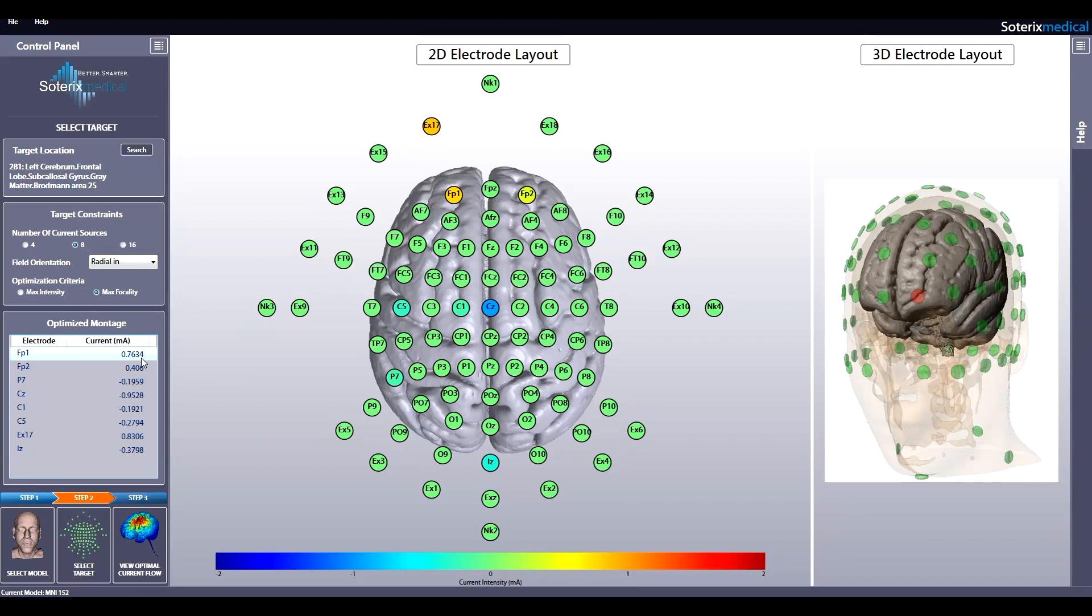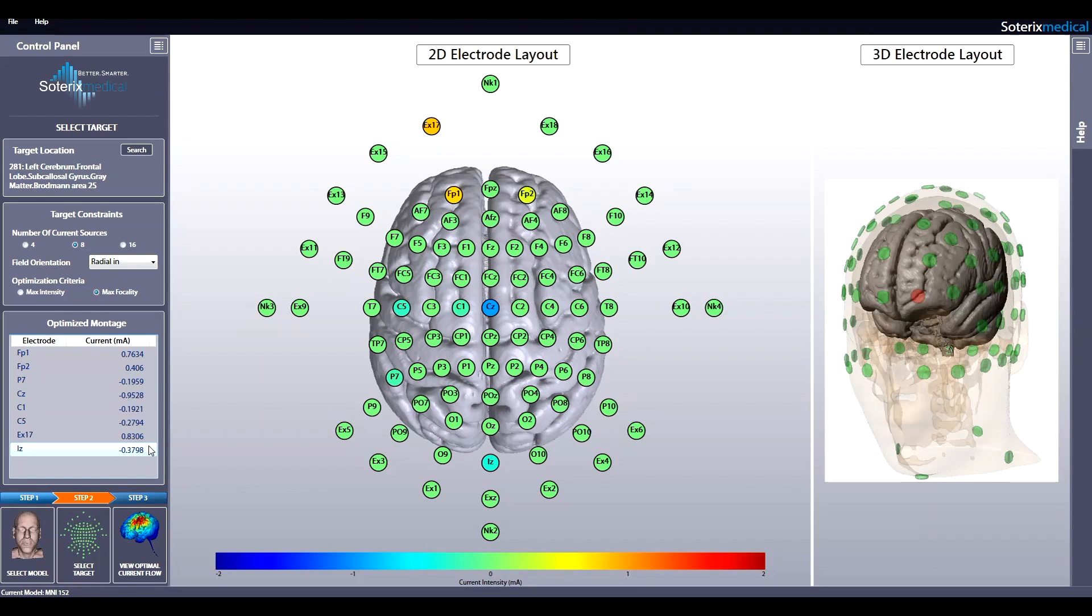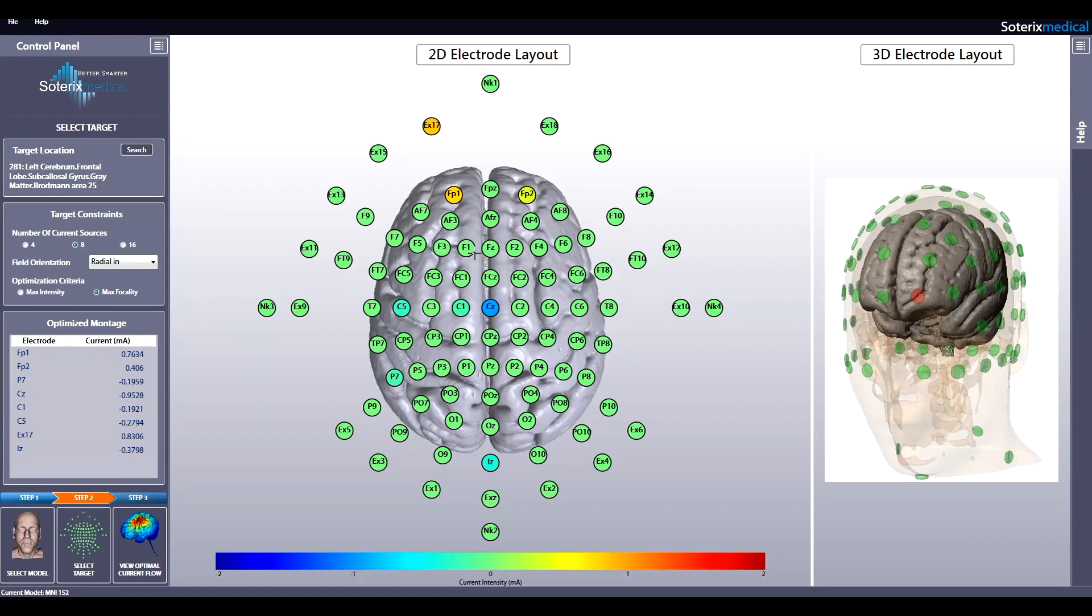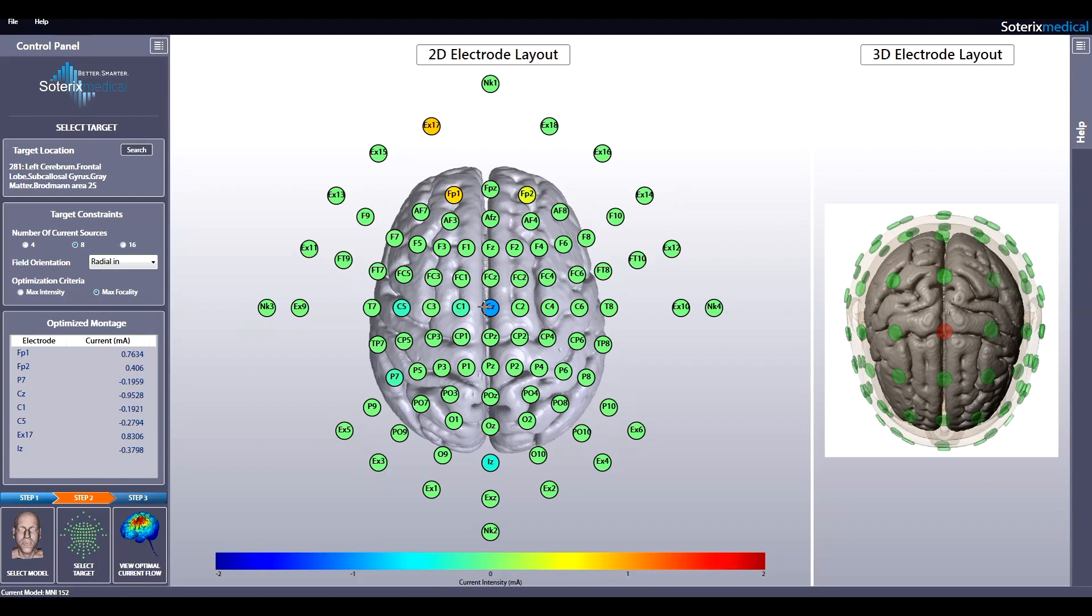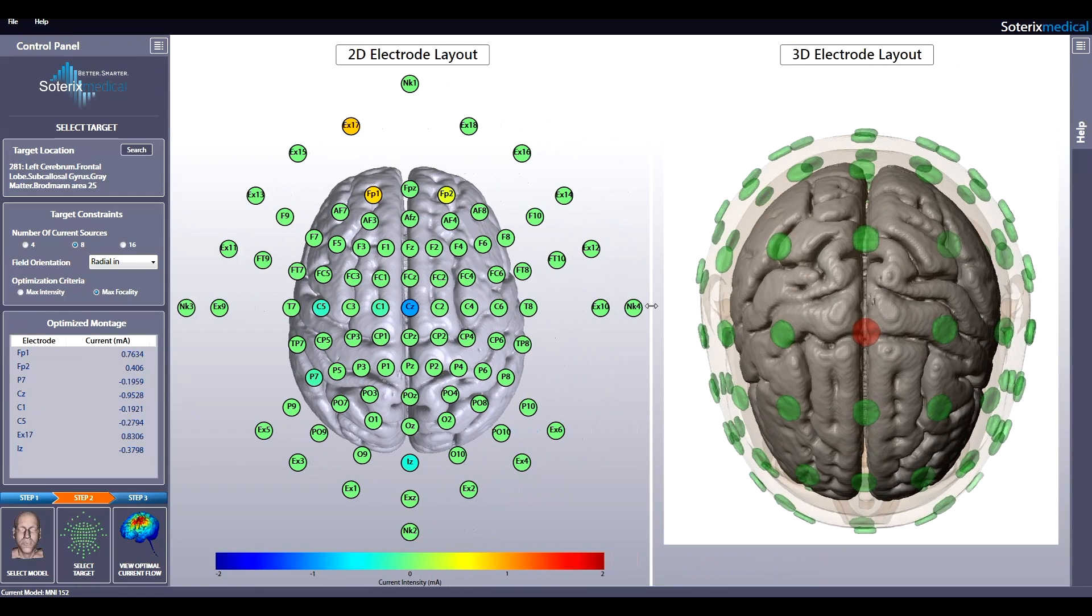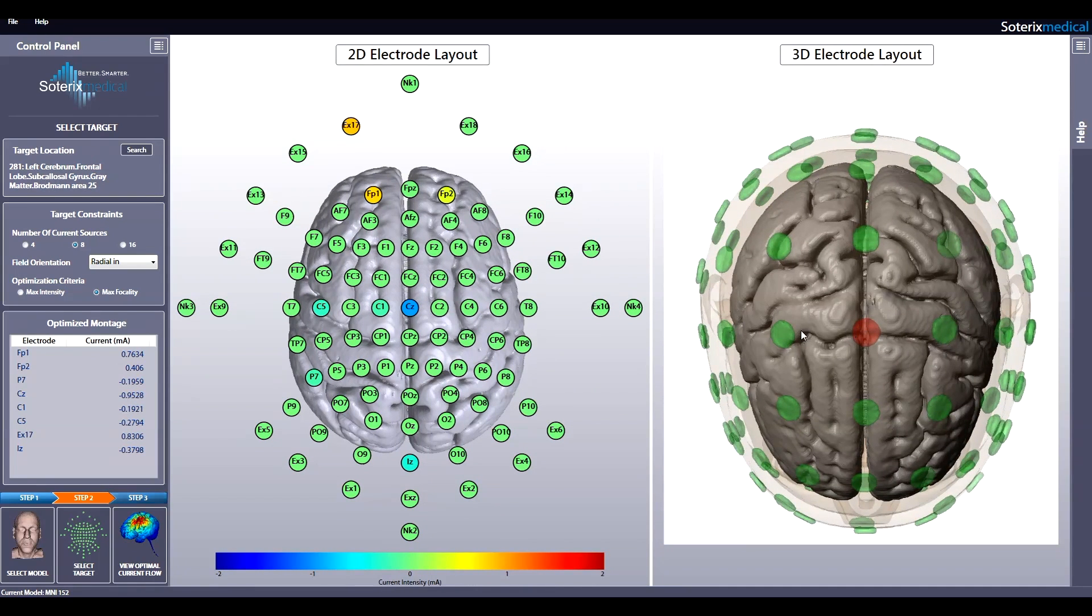If you selected 8 electrodes, 8 electrodes are used in total. To visualize where each selected electrode is located in relation to the underlying brain, you can click on the location in the 2D electrode layout and observe the corresponding 3D electrode layout. The selected electrode will be displayed in red, while the others stay green.